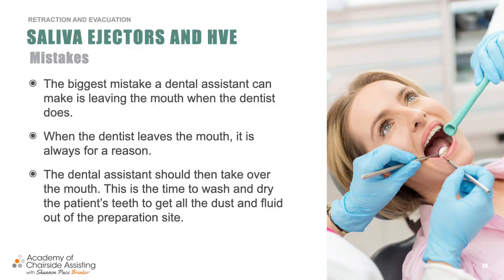Now, when the dentist is preparing a tooth, we always want to make sure that we're keeping everything clean, keeping the dust from flying everywhere. But the biggest mistake we make as a dental assistant is leaving the mouth when the dentist is still in it. Never, ever leave the mouth while the doctor is still in. And only get in there really quickly if you need to when the doctor leaves. The other thing is that the dental assistant can then take over the mouth when the doctor leaves so we can rinse and wash everything really great, keeping everything nice and clean, but most importantly, getting rid of that tooth dust or any fluid, saliva, anything that's on those preparation sites so the doctor can come back in with a fresh set of eyes, okay?